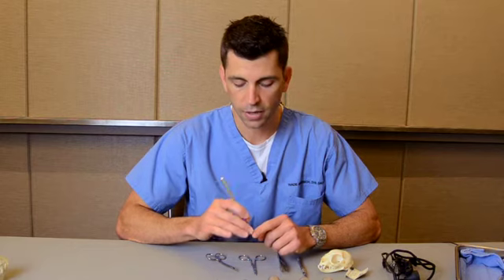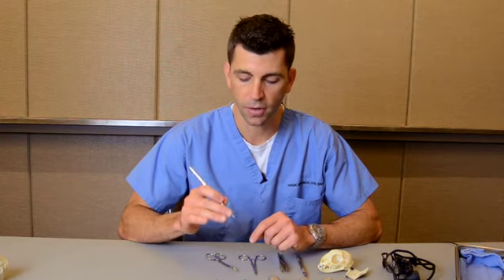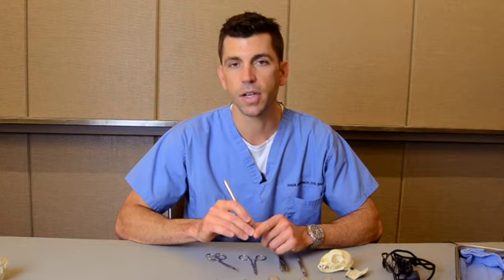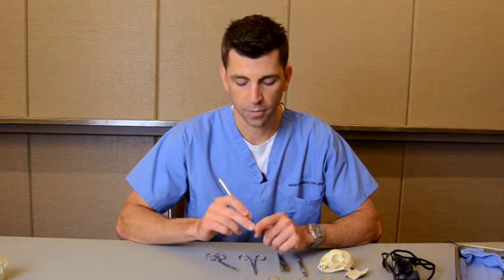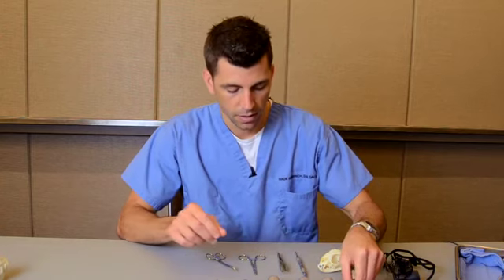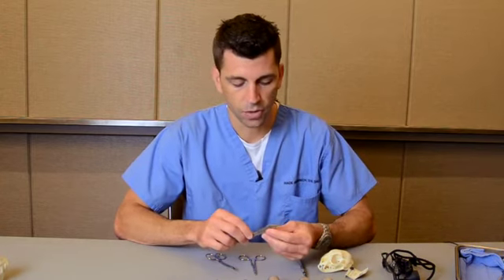If you do apply any force apically at all, always have a finger rest or finger stop on the instrument, so that if it does slip, you're going to prevent it from penetrating into tissues where you don't want it to be. Next, I'm going to talk about thumb forceps.